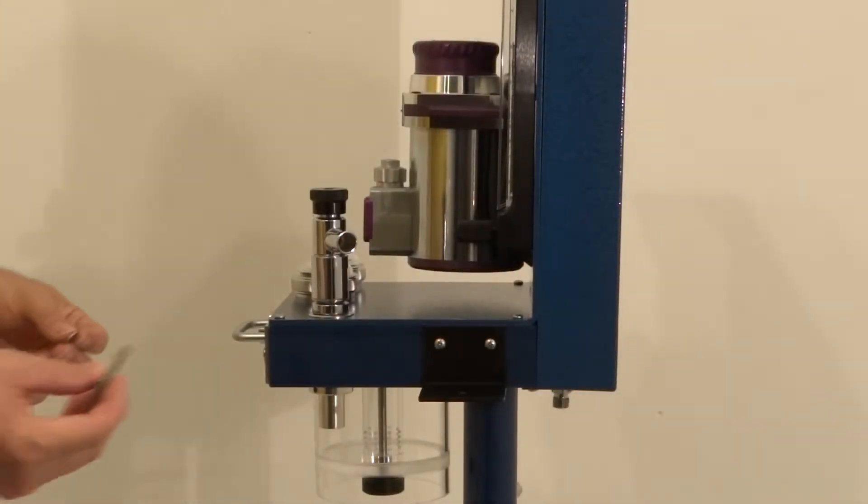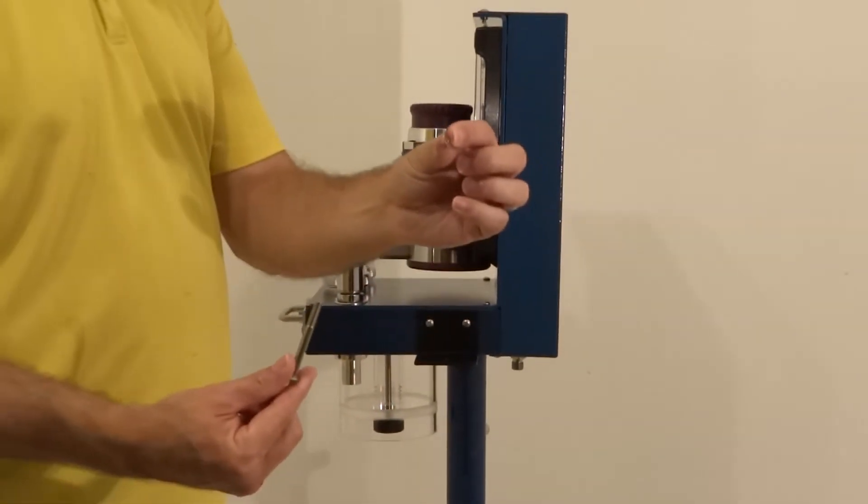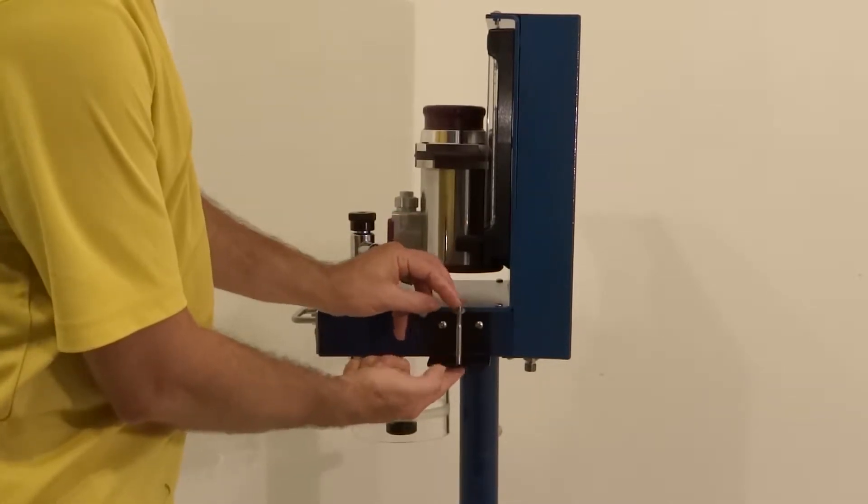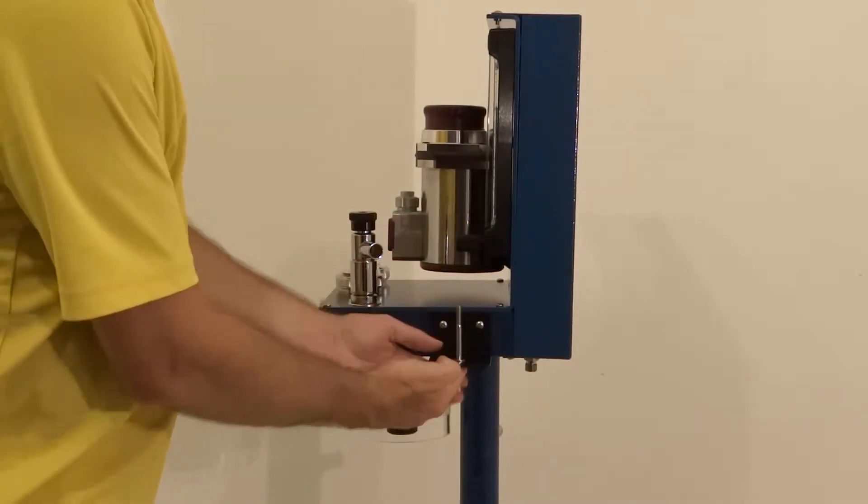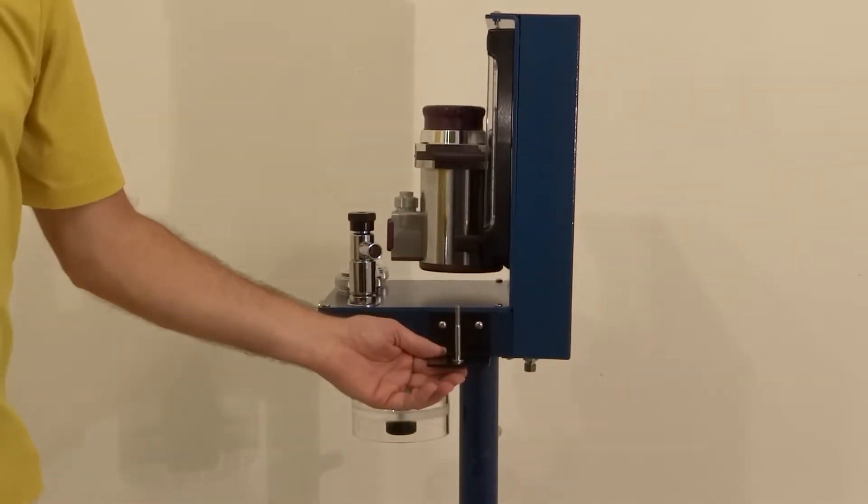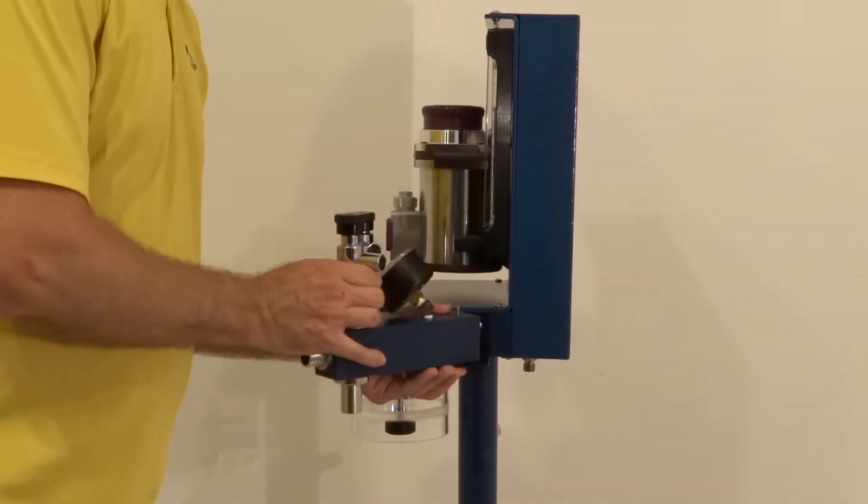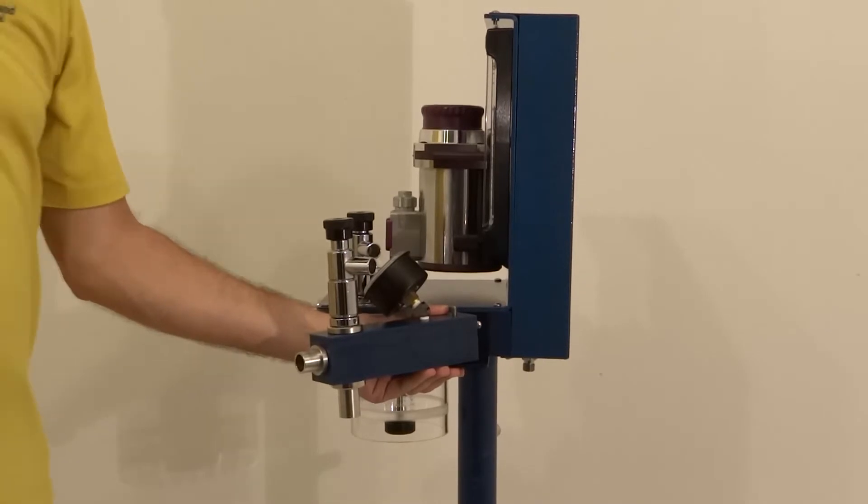Next, place the supplied bolt up through the hole of the bracket and place the supplied washer onto the bolt. Place the Bain Adapter onto the bolt and then thread the supplied knob onto the bolt and tighten.